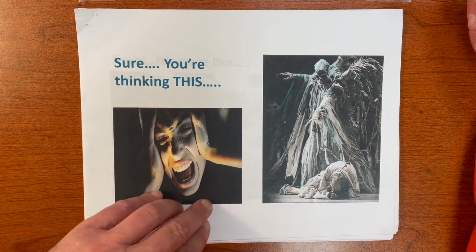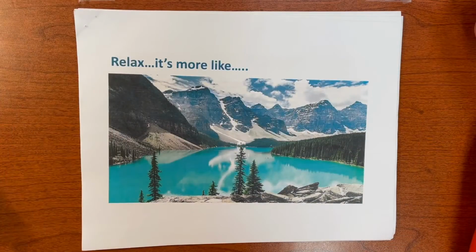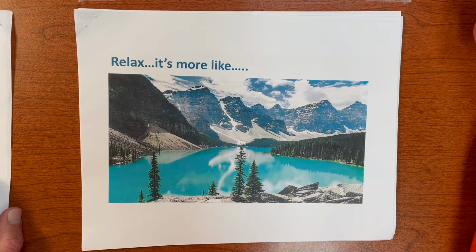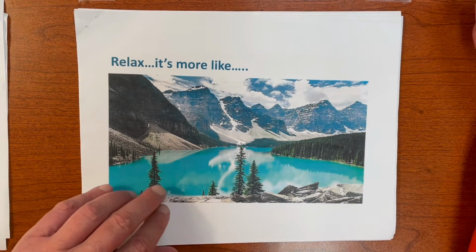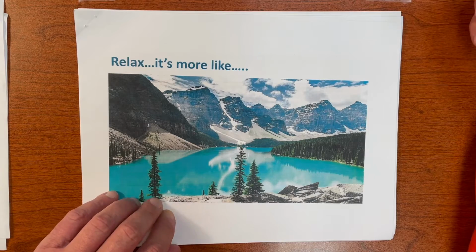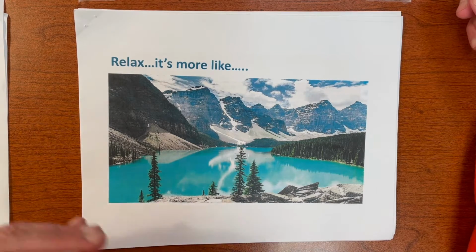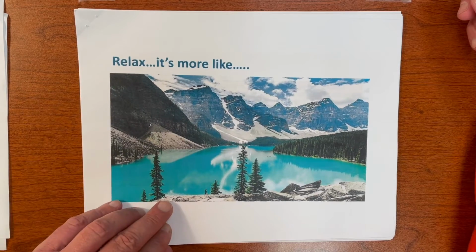So instead of this, actually, our goal is to make it like this. And what we're going to do is we're going to use just several concepts, okay? We're going to develop a checklist, all right? That'll put you in the ballpark 99.9% of the time, all right? So this first session is not about all the details. It's getting you to think a certain way and to give you an overview.